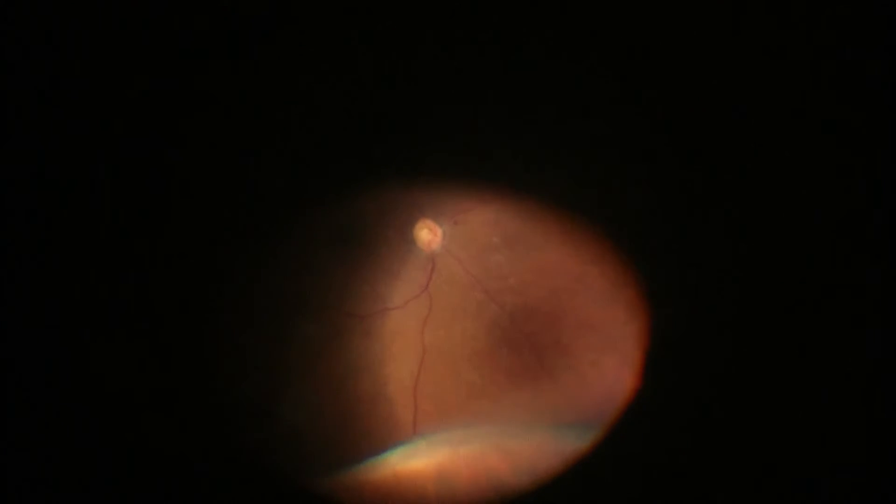What we're doing over here is inspecting the retinal periphery. It's a key step for any vitrectomy to make sure that there are no occult peripheral breaks over here. We're going to do that 360 degrees into the eye. We're not going to necessarily show every single quadrant, but you definitely want to do your due diligence and explore that. So far, everything in the peripheral retina is looking good. I'm not seeing any breaks or tears. It's also reassuring that for this patient, we're going to apply panretinal photocoagulation 360 degrees, and so any small break or something else there, we're going to be able to cover and treat that.